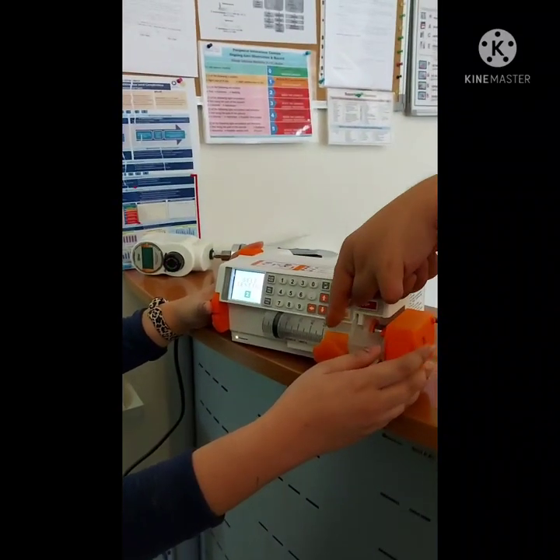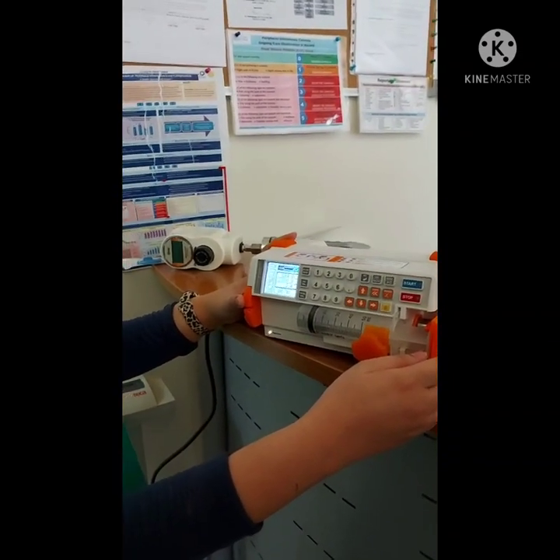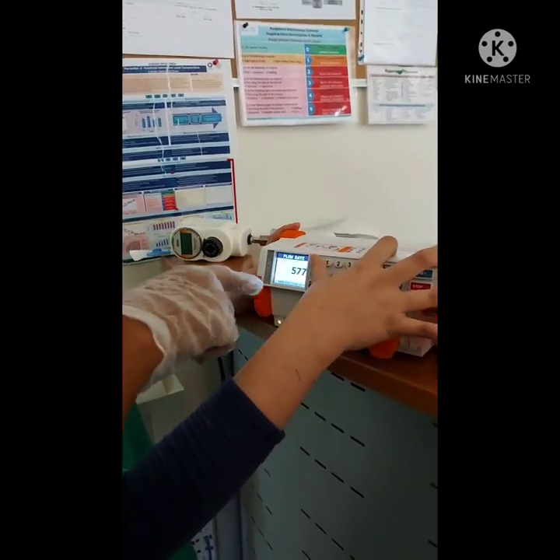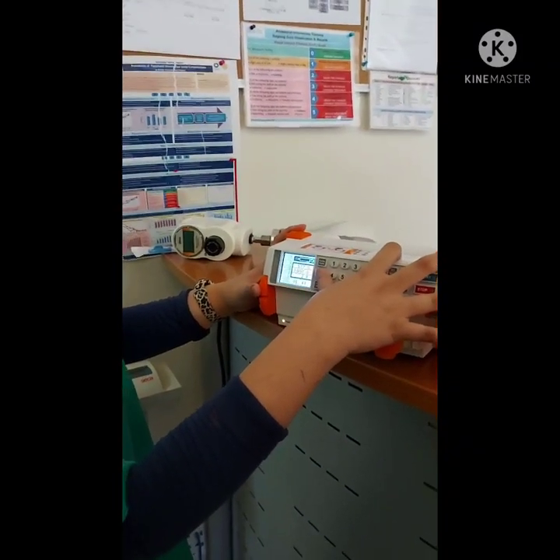It's for 50 ml or 20? I think only 50 per syringe. So you can put only 50 there. Because the syringe is 50 only. You can use the other also, but okay.